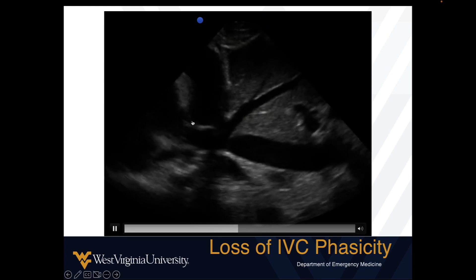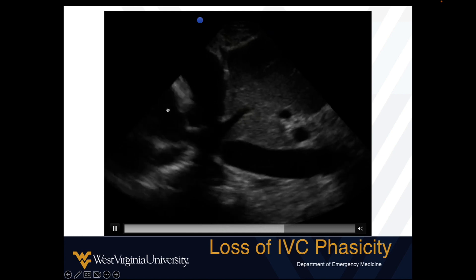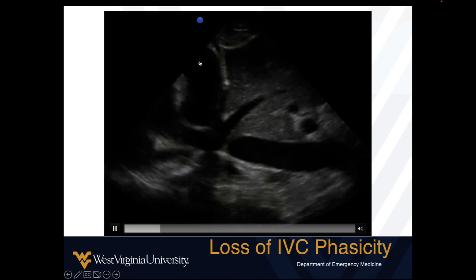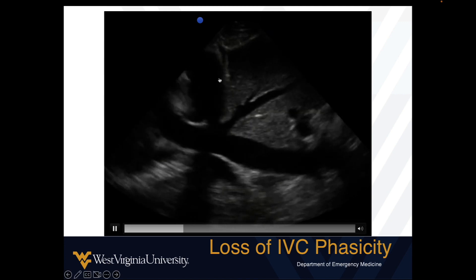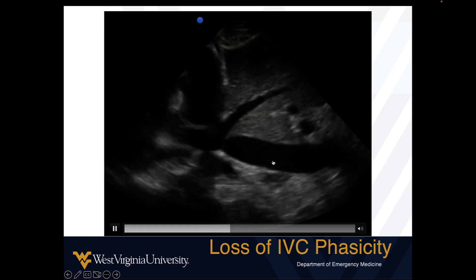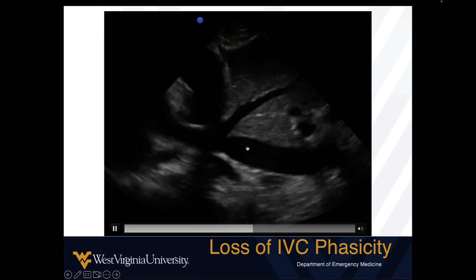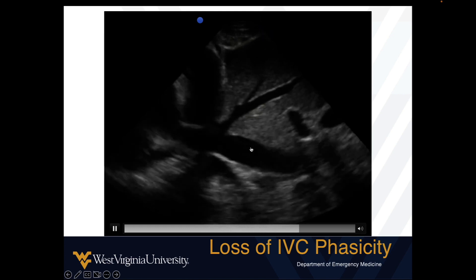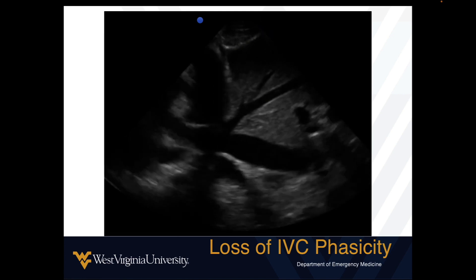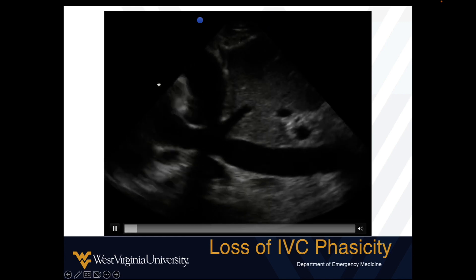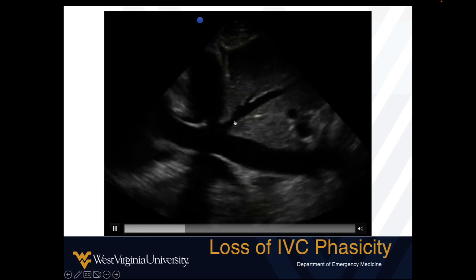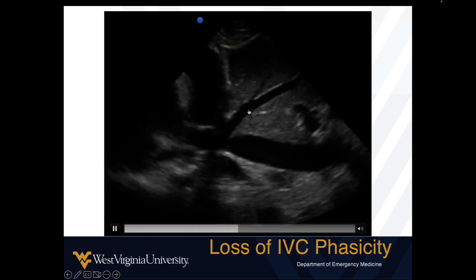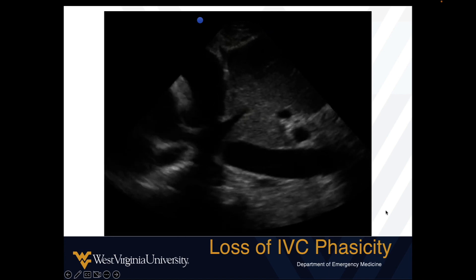This is a case of tamponade — we see the right atrium and a large effusion causing this patient's shock. The IVC is dilated and does not change shape at all with respiration. We also see that dilation transmitting into a dilated middle hepatic vein.